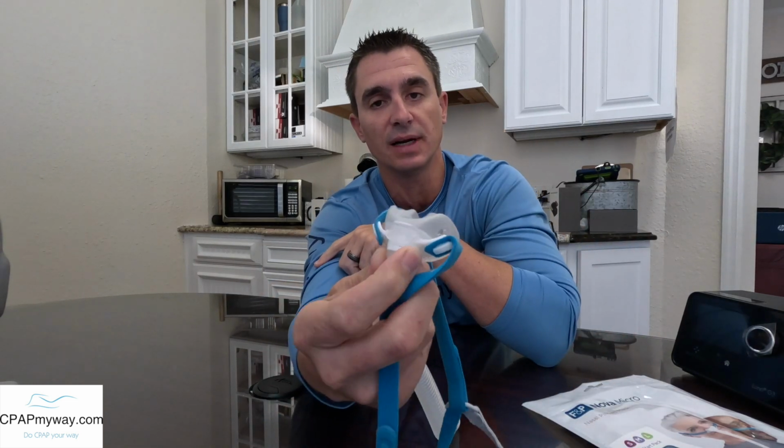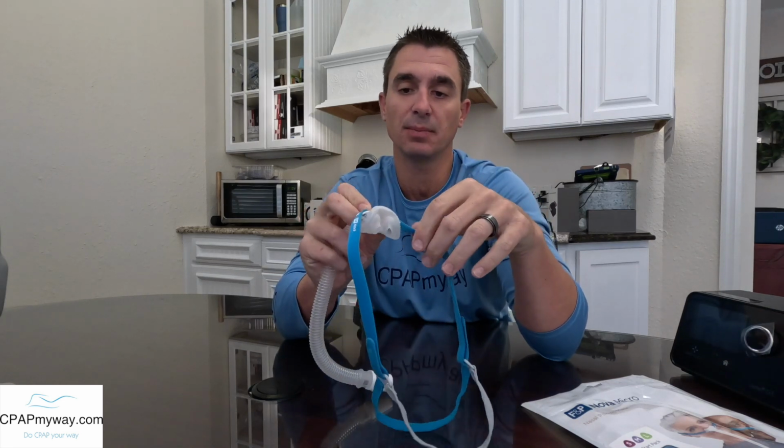It wants to rotate, so you kind of have to hold it firm there, but just slip that under and then pull that little top wing right back over, and you are back in business. So really simple. I think some people are going to like that you don't have to line up clips and get things just right to snap into place. All you do is fit it on there and stretch it over.